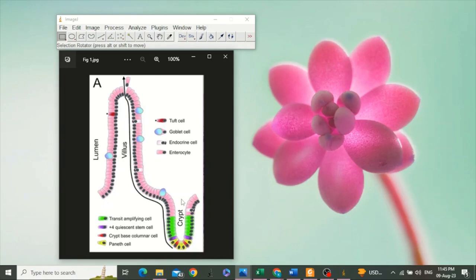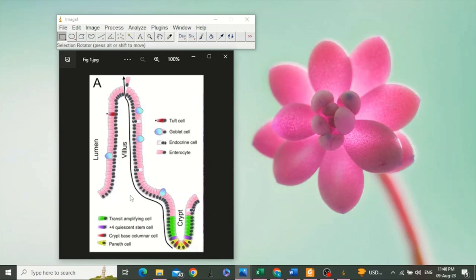Crypt depth is measured from the base of the crypt to the level of crypt opening. You can see this is the transitional region between the villus base and crypt mouth opening. For the measurement of villus height, crypt depth, and villus width, first we have to calibrate ImageJ.